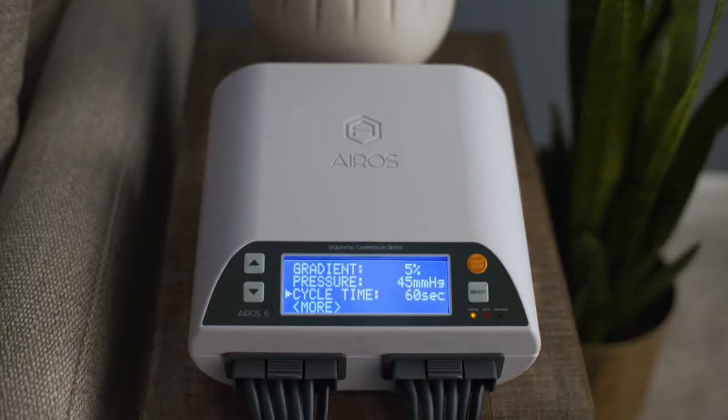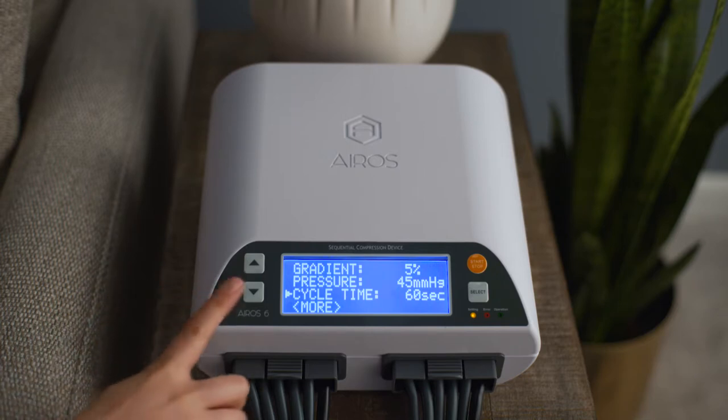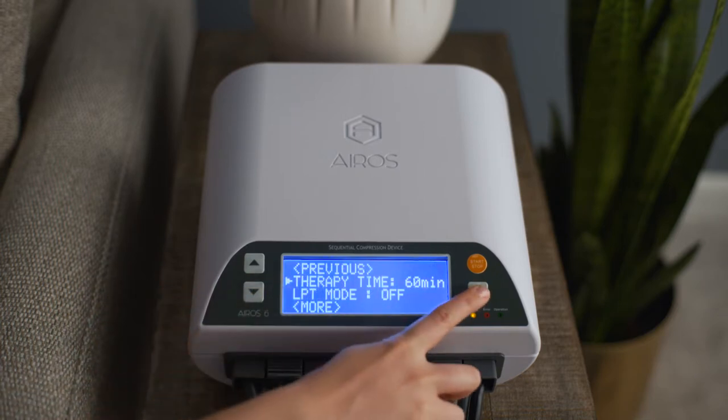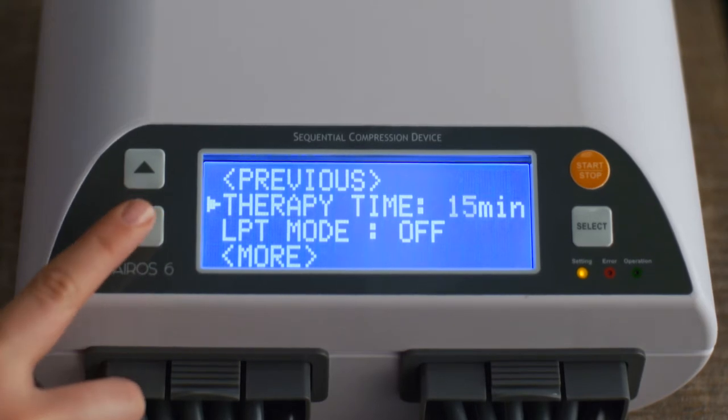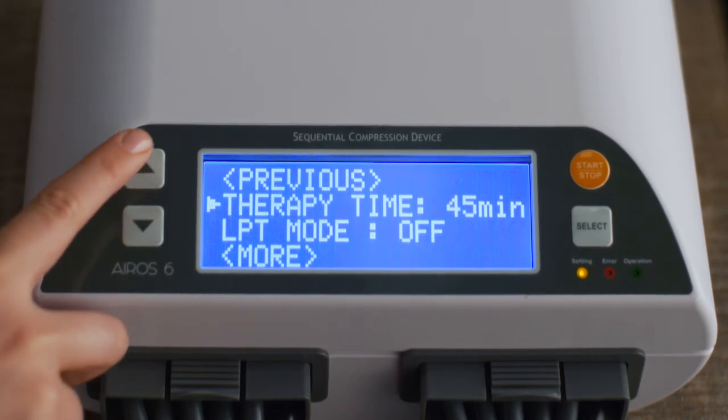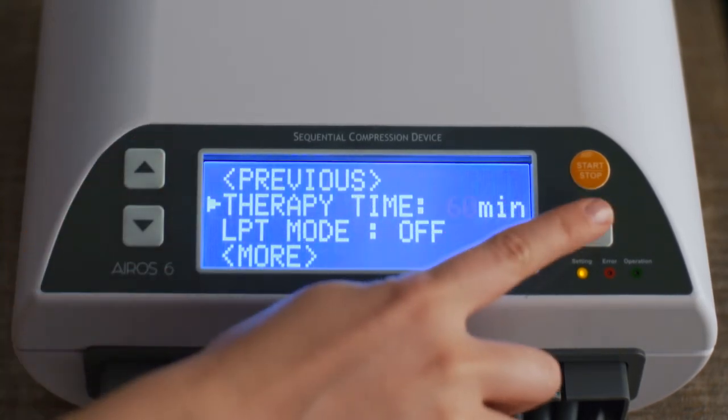To set the total therapy time for treatment, scroll to Therapy Time and press the Select button. Therapy Time can be set at 15, 30, 45, or 60 minutes. Press the Select button to confirm your selection.